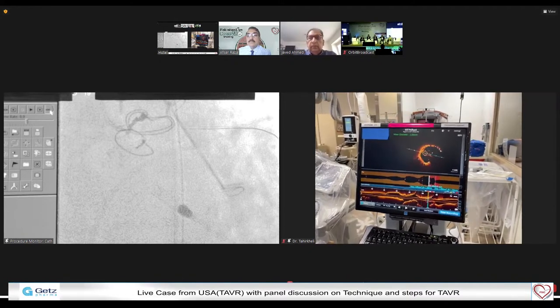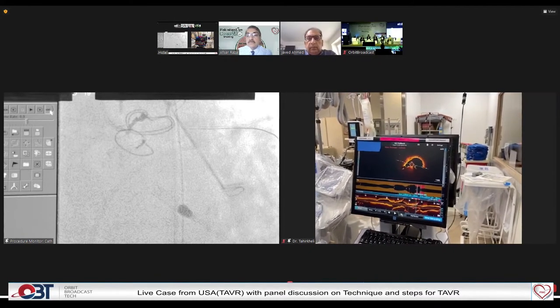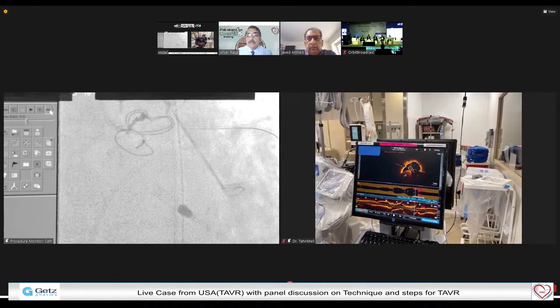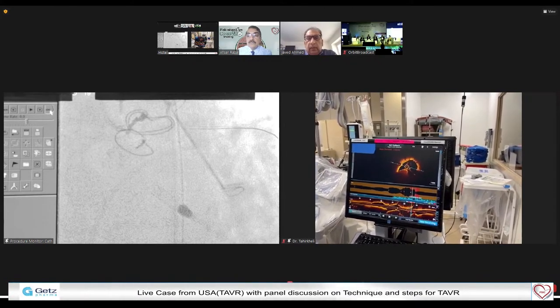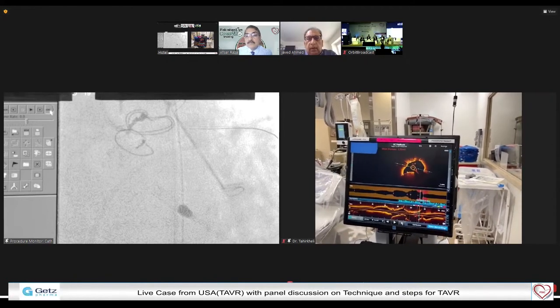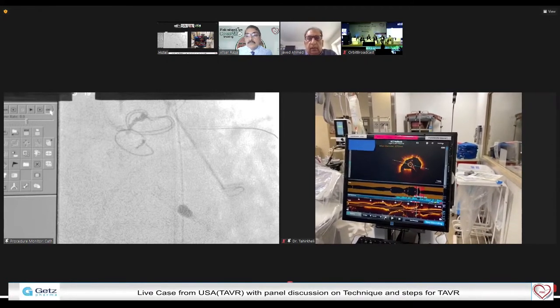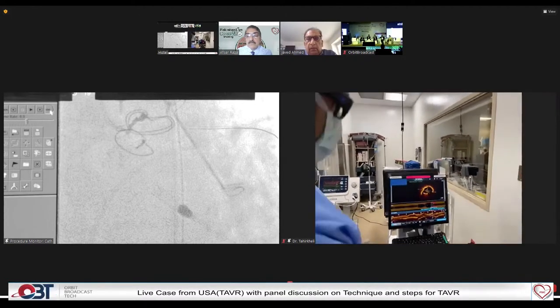And now we're in the left main. Go forward, right at 7 o'clock you can see, we were debating whether this is a red thrombus versus a calcified nodule right there at 7 o'clock. But you can clearly see the stent is under-deployed. It's a 3.5 vessel, and it's a 2.5 stent in there.